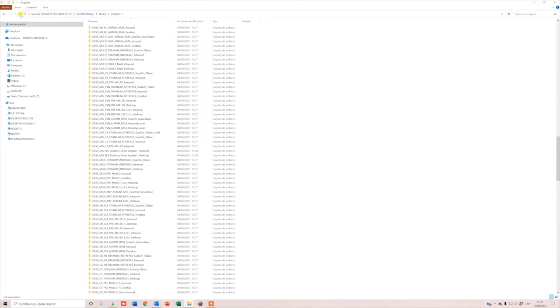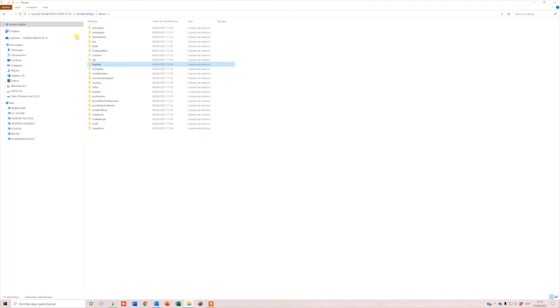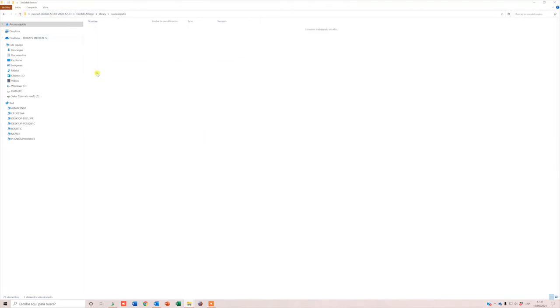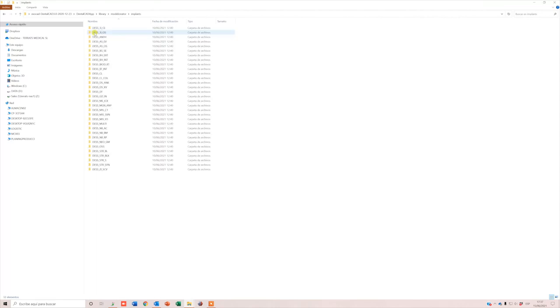For model creator files, go to Model Creator folder. Open Implants folder and paste there.